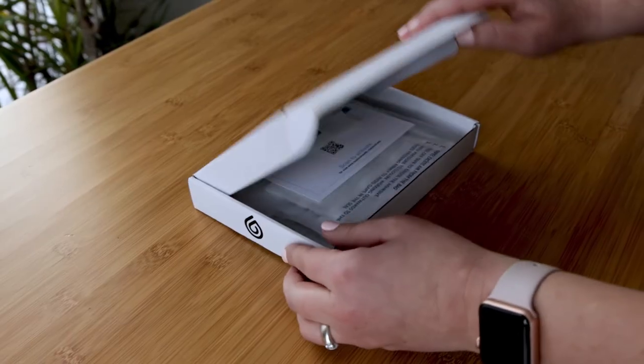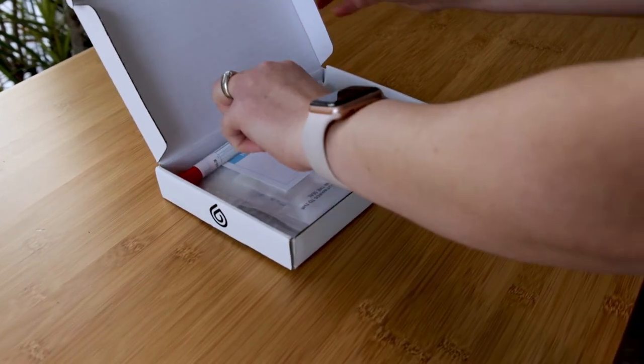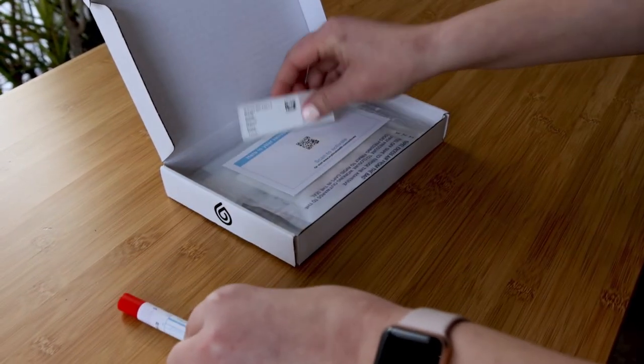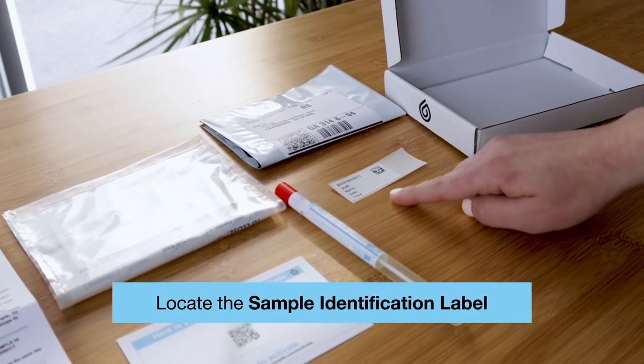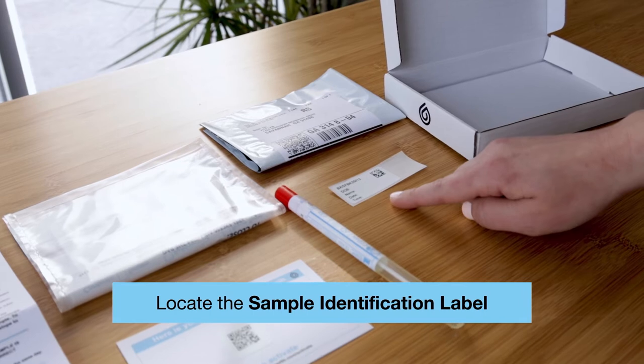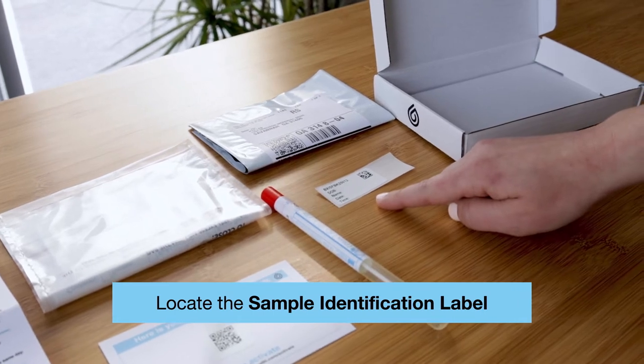If you're ready, then let's get started. First, open up the sample collection kit and lay out the contents on a clean surface. Please locate the sample identification label that is included in the materials. This contains your activation code.